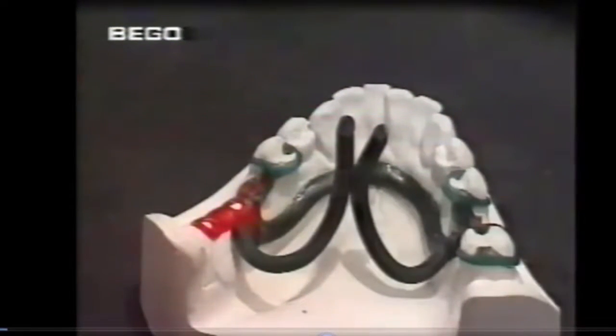This, however, is provided that the sprues are fixed in a manner appropriate to the casting technique, which is determined by the following general rule. The melt must be able to flow into the muffle cavity rapidly from thicker parts to thinner ones. Kinks, excessively long sprues or constrictions slow the flow, causing defects or porosity.